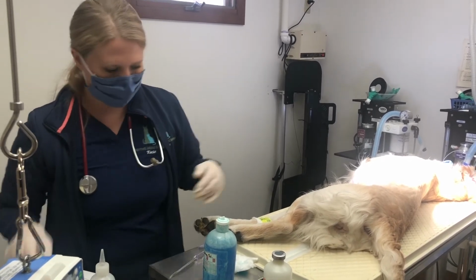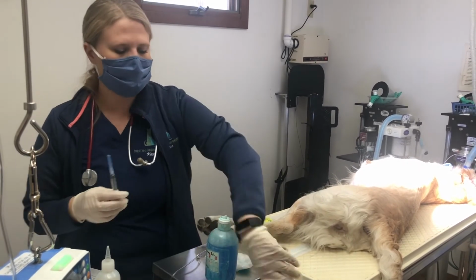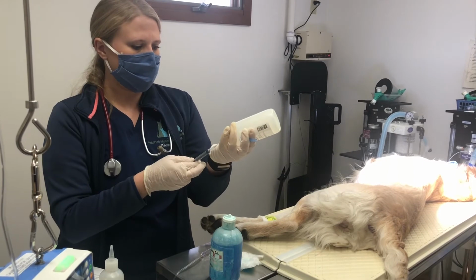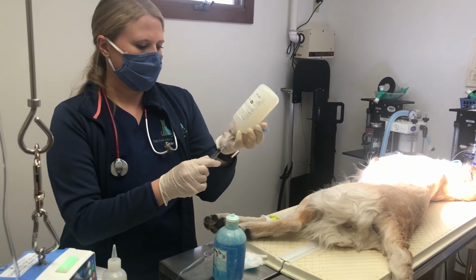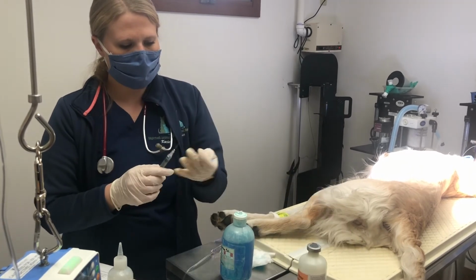I've got my sterile swabs. I do need to moisten them then with some sterile water. This is just our sterile water solution.